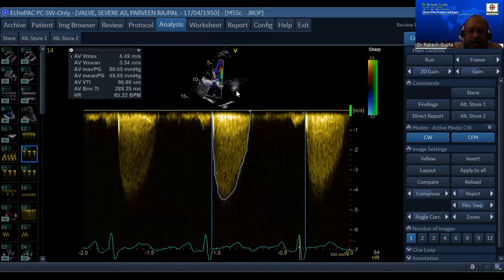And out of these 6, we do not have to do average. Wherever the maximum is, we calculate the gradients, take the maximum gradients across it. Why so? Because aortic valve leaflet is a tri-leaflet cusp. The stenotic jet could be in any direction. And I give you the example. If you pinch a pipe which is sprinkling water in the garden, depending on pinching, the direction of the water can be in any direction. So it's a pinching of aortic valve, the jet could be in any direction, and we try to look at them in 6 different windows to get the maximum gradients.